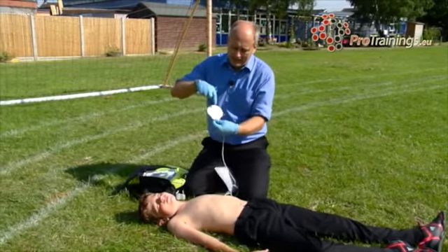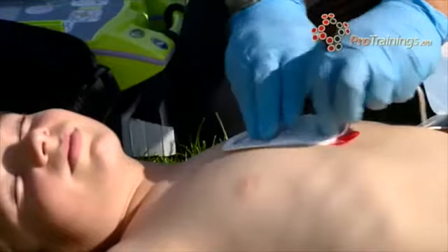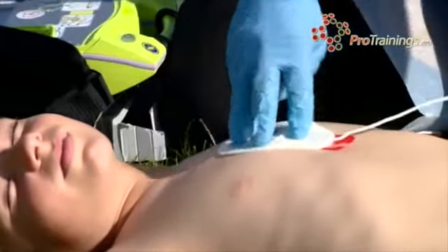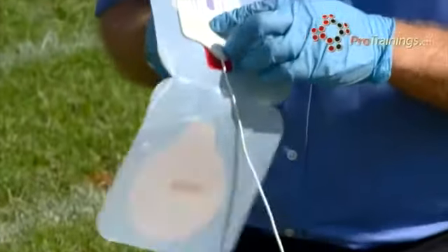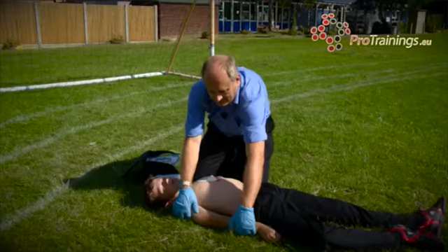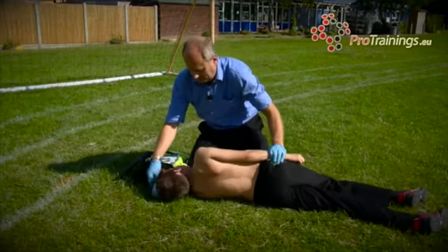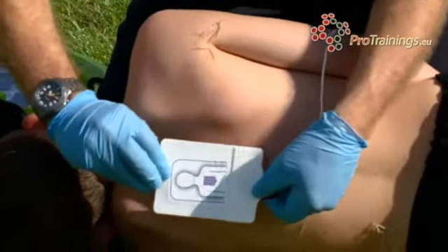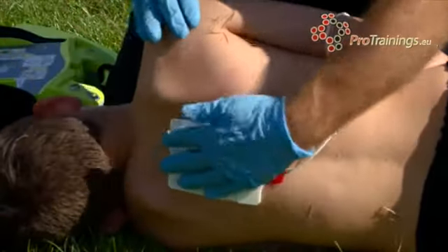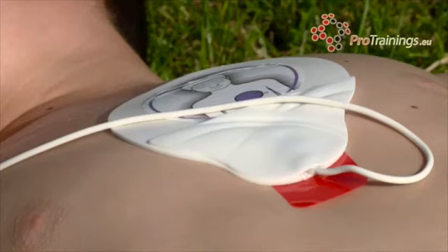So we're placing it just on the chest, just slightly over, so it's over where the heart is. So we're just popping it straight onto here. With the other pad, it comes off in the same way, and this is going in the center of the back. So we're going to have to turn him over. With this pad, just make sure there's nothing in the way. We're placing it between the shoulder blades on his back. Push it firmly there, and then we can roll him back over. Now we've got the pad on the front and on the back.